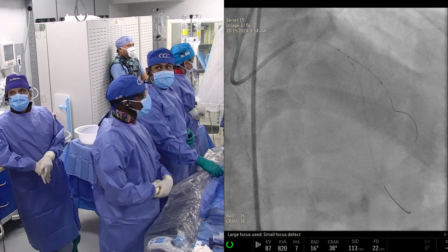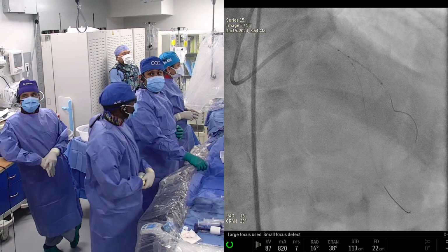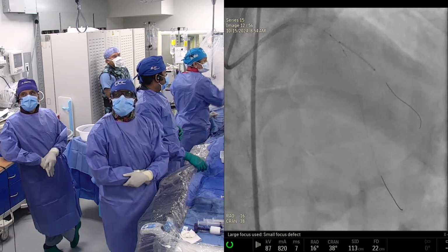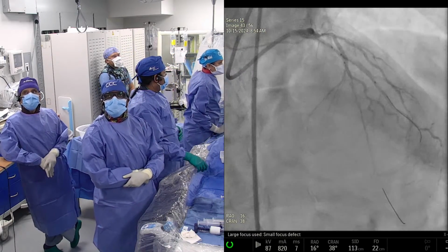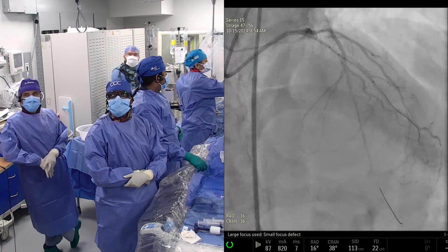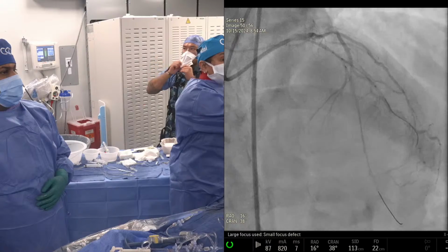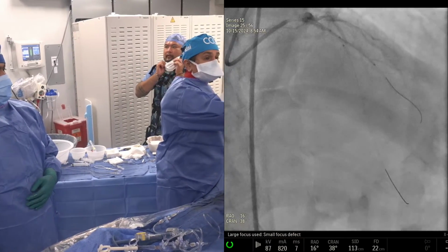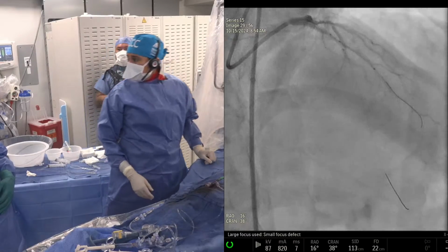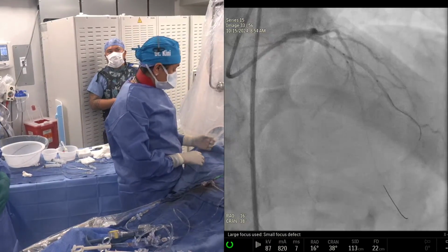Anu, you were going to tell us something about the case? Yeah, so this is where we are. This is the placement of the stent. And if we need to do the drug-coated balloon, we can put a 2.5 by 30 drug-coated balloon. Try to look. There's no 40 millimeter, right? Let's go with a 2.5 by 30 if we have it. We may decide. If you want to, you can decide with the case of the distal.